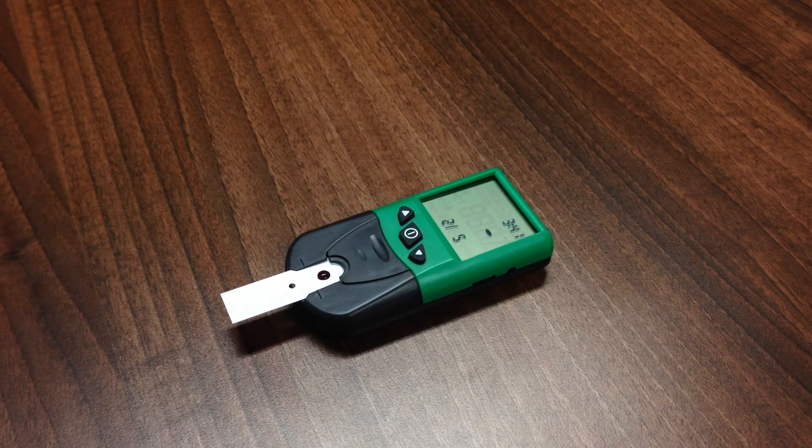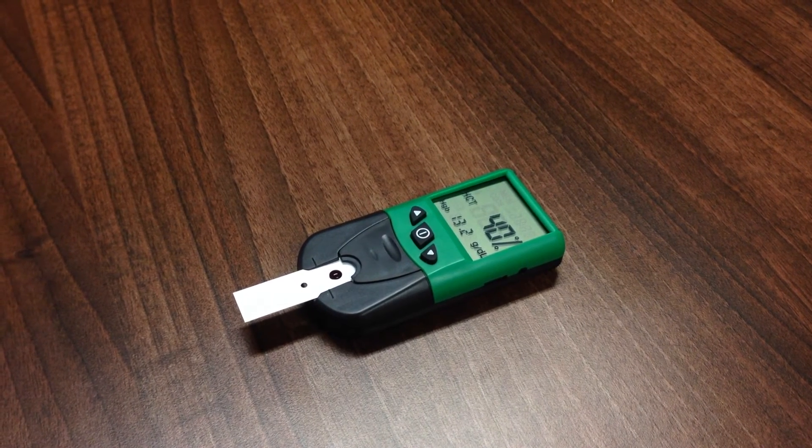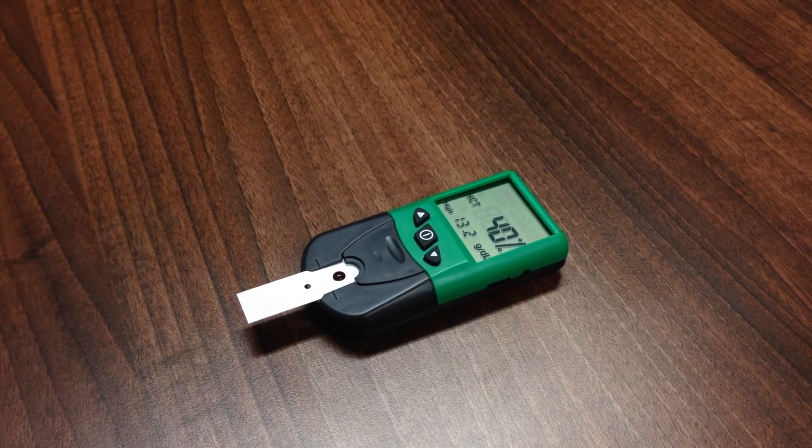Each test strip is for single use only. The test will begin automatically. During the test, do not disturb or move the meter or strip, or press any meter keys. The test result will be displayed in less than 30 seconds and will be stored automatically with a time and date.